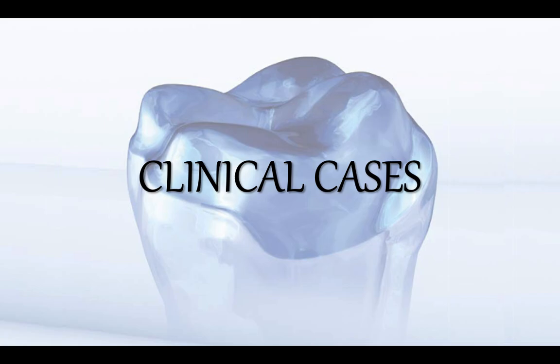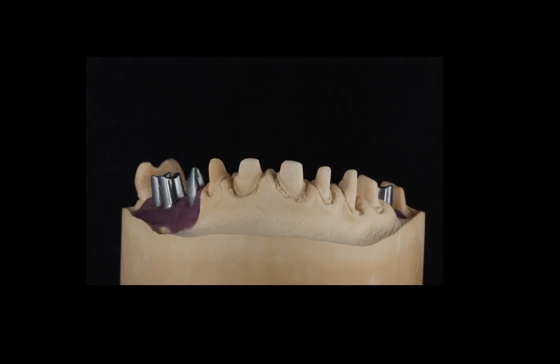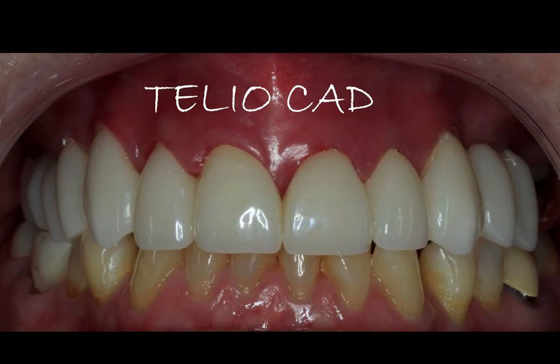So let's see a couple of cases here. This is a big case that I did a long time ago, and I just wanted to show you that this case was probably my first case where I used the TelioCAD milling machine. I used the TelioCAD blocks and the milling machine to perform these provisionals.